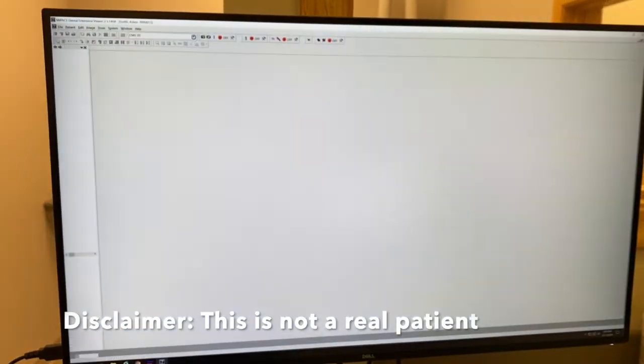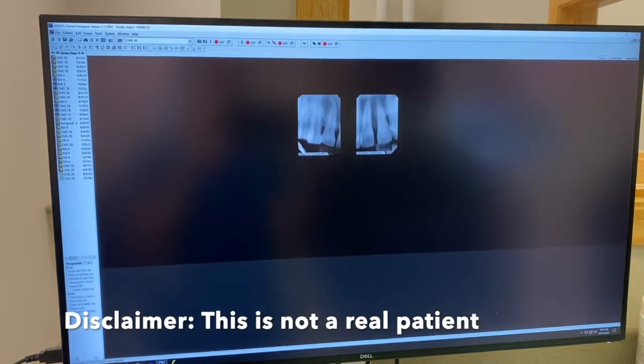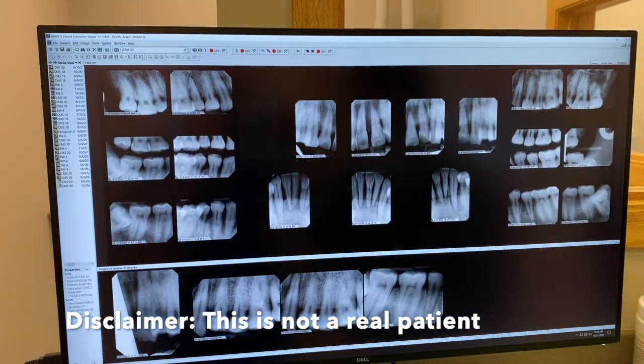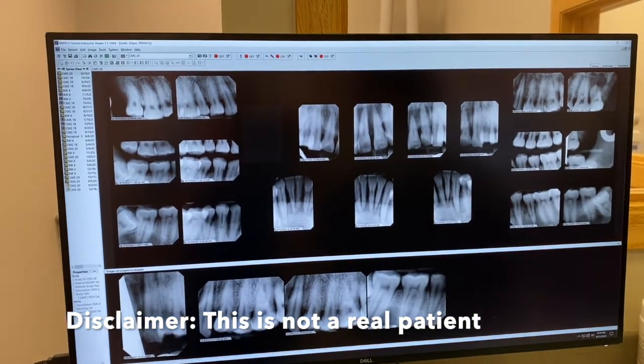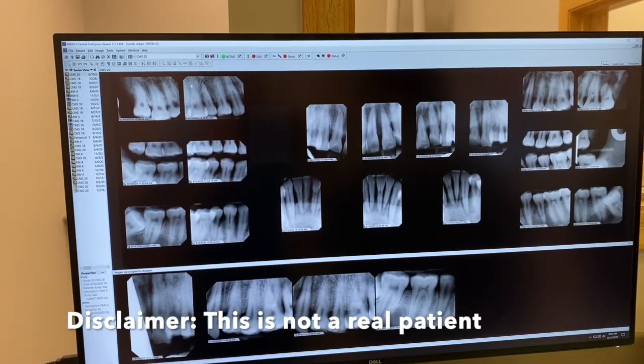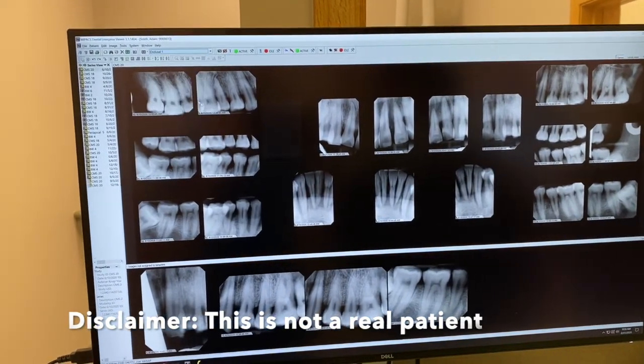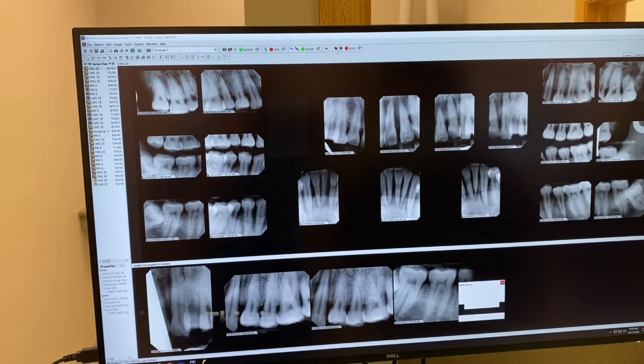There will be a drop-down option at the top left of the screen. Here you will click the box, click occlusal radiograph, and activate the sensor.